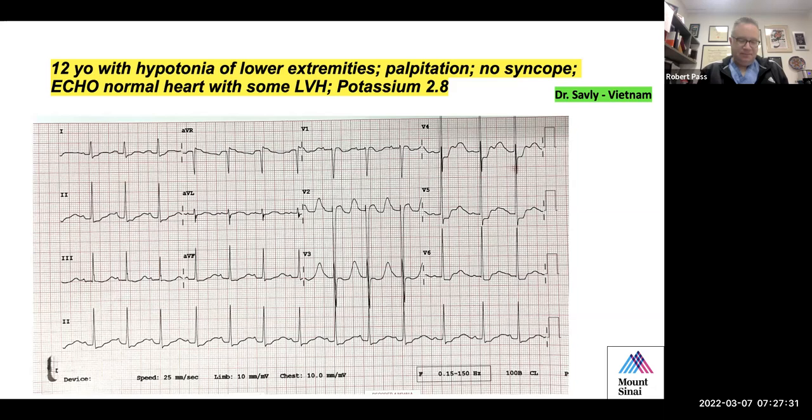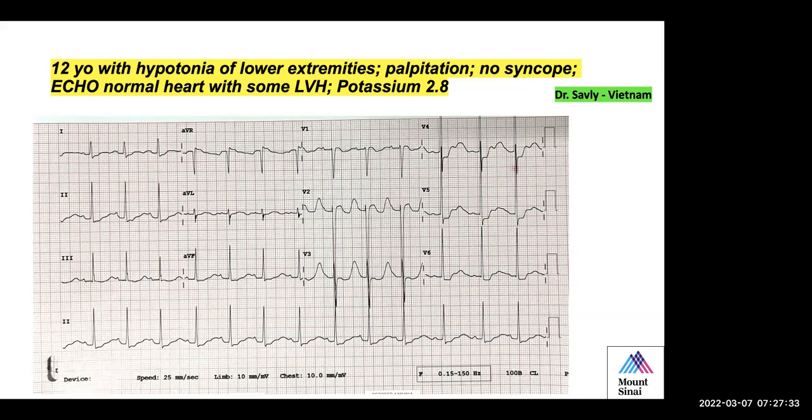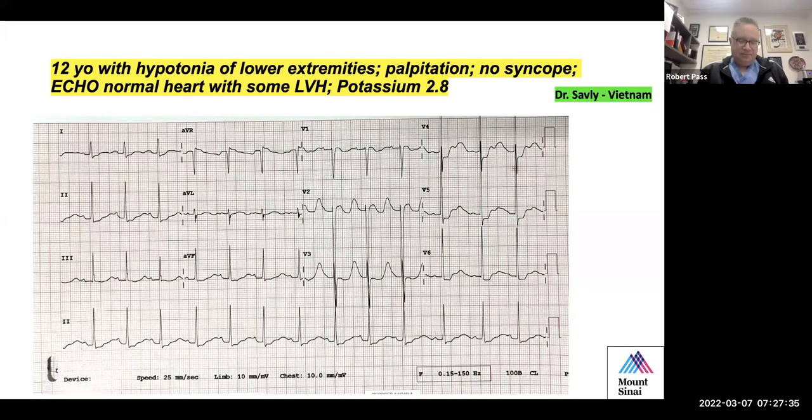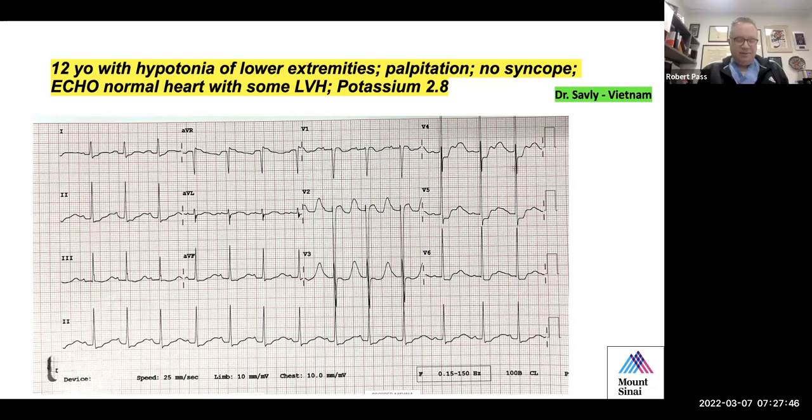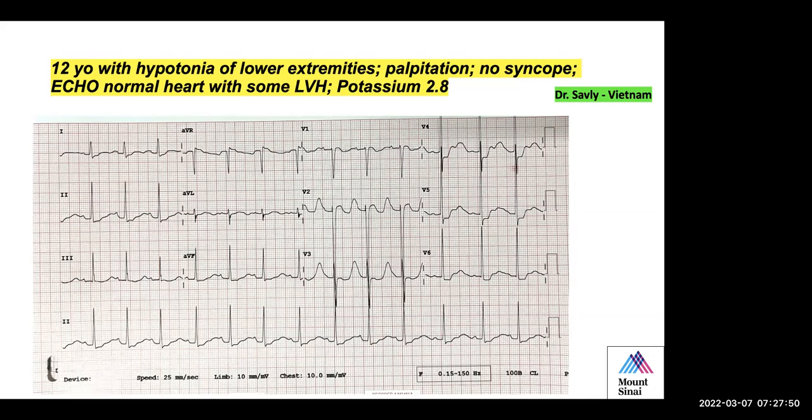Almost like 15 small boxes. I'm just doing the calculation. Go right ahead. I'll even give you 3 minutes. Yeah, it's coming out very high. I'm getting like around 700.